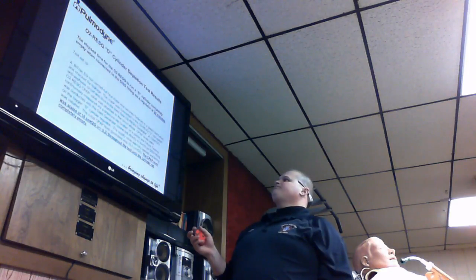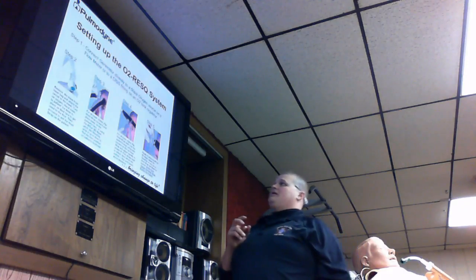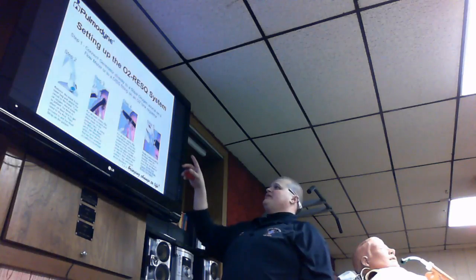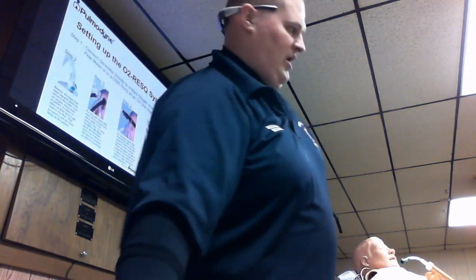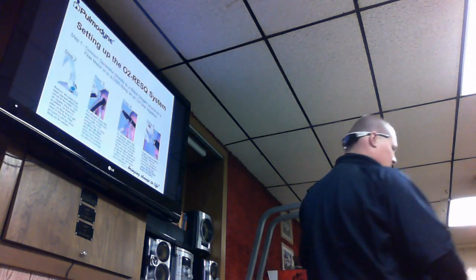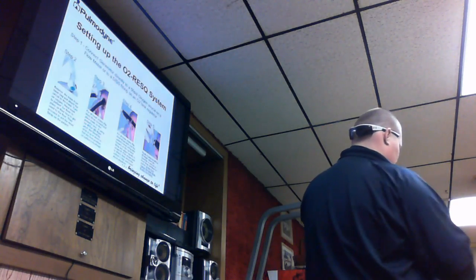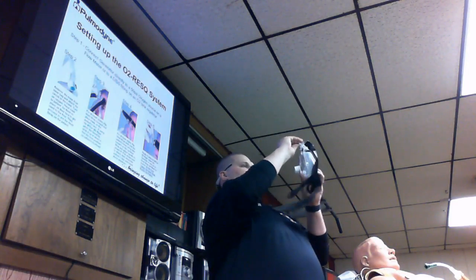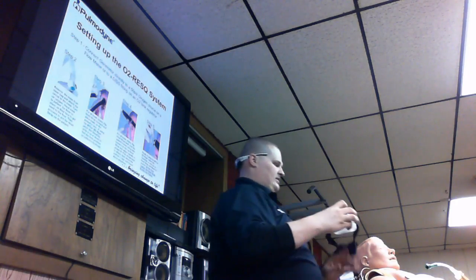Okay. We'll get on to actually, this is our main step, okay? So, what this is going to do, step by step, is we're going to talk about what we have to do first, okay? So, what we need to do when we put on our CPAP is, we need to make sure we find the right size mask. What I do is most people are usually a medium to a large. Don't really come across a whole lot of people that are smalls. But right here we got our mask and we got our little, as you can see right here, we can squeeze and adjust this headpiece up and down like such.